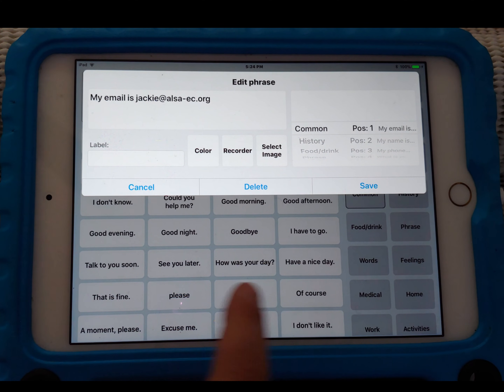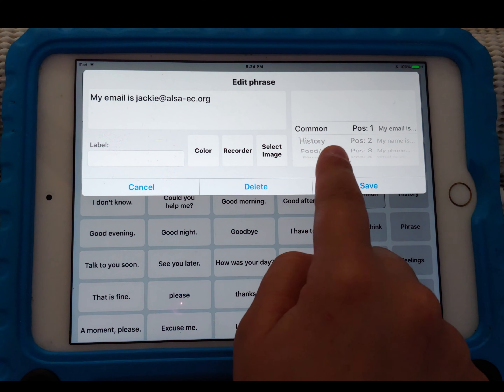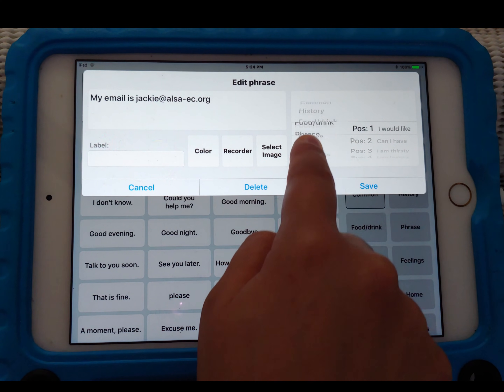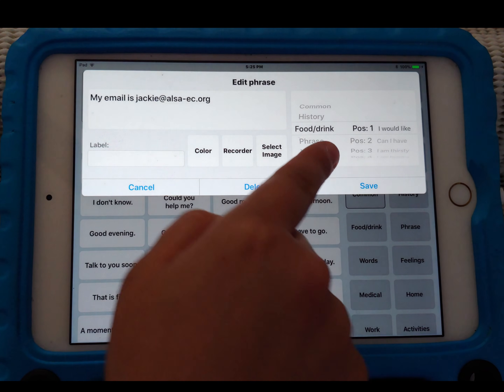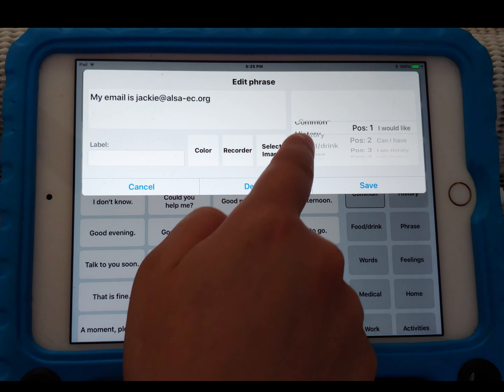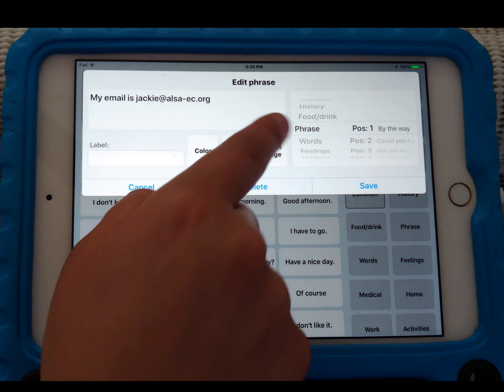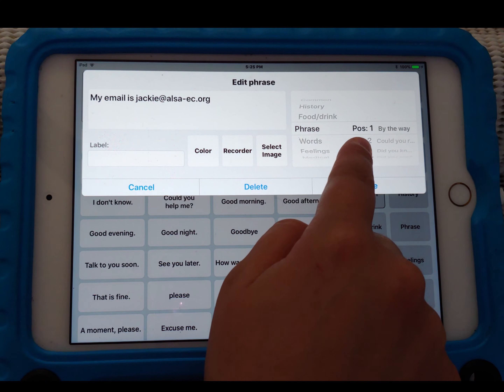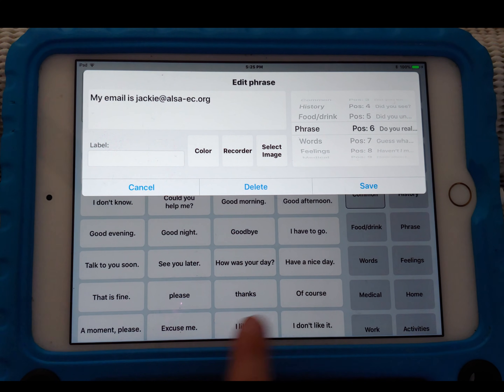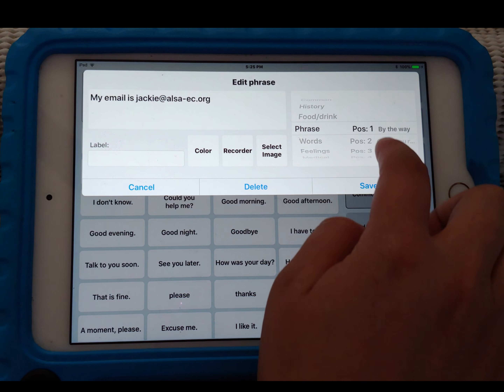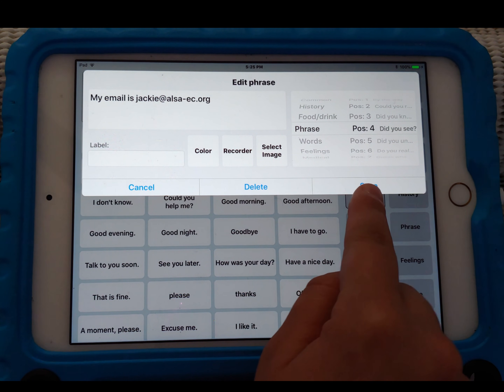Then minimize the on-screen keyboard. You have options to choose what category — these are the categories you see on the homepage bottom right. So I'm going to change it from common to the phrase category. There's also a position setting, so you can change the location of the phrase in the phrase box. I'll put it at position four. Then you have cancel, delete, and save.